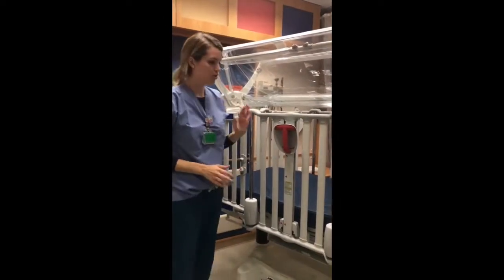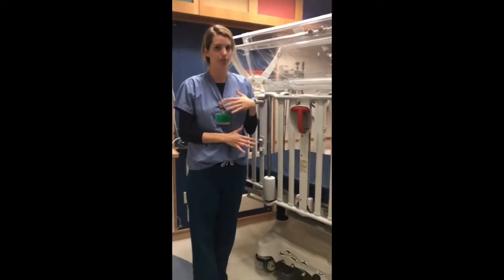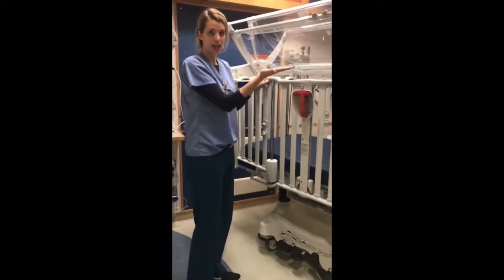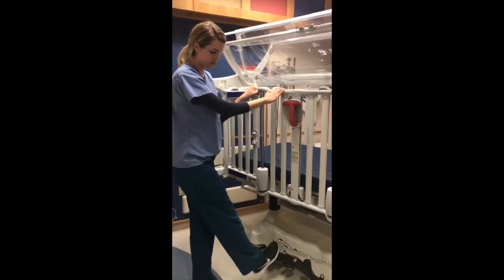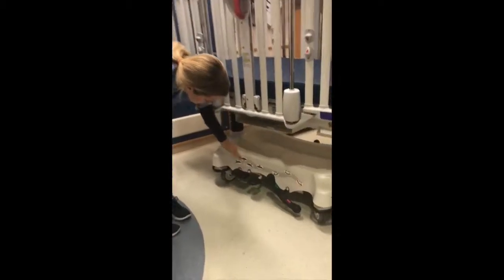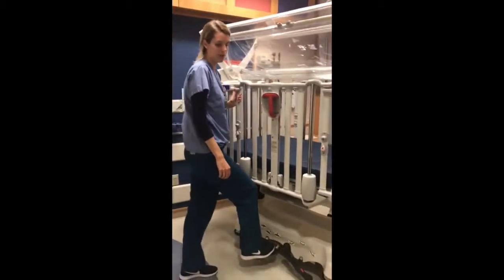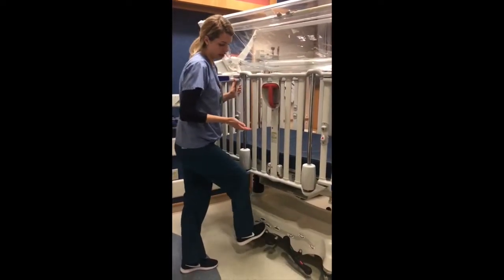Next, I'll show you how to adjust the crib to an easier functioning position. You have the option of raising or lowering the height of the crib mattress by using the foot pedals at the base of the crib. You can see the pictures here with the arrow up or arrow down to raise or lower the crib. Simply pump the foot pedal and the crib mattress will raise up, or push down to lower it.